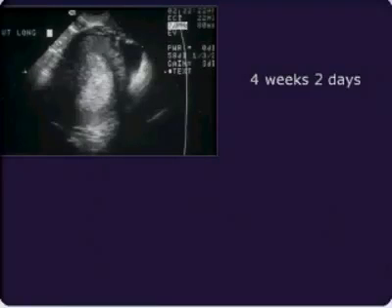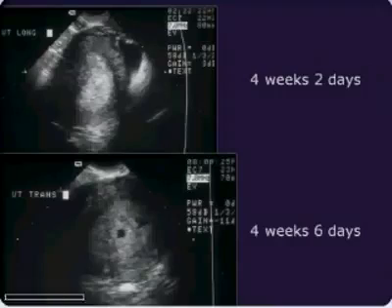All right, so she goes away, and she comes back 4 days later. Now, when she comes back, it's now earlier, but it's still off hours. It's 8 p.m. here. All right, so resident 2 scans her. Now, resident 2 has it infinitely easier than resident 1 because what we see now is a little sac, an intradecidual sac sign right here. Here's the endometrial cavity. In fact, we almost have a baby double decidual sac, don't we, with the gestational sac and the endometrial cavity there. All right, so now we're feeling much better about this.